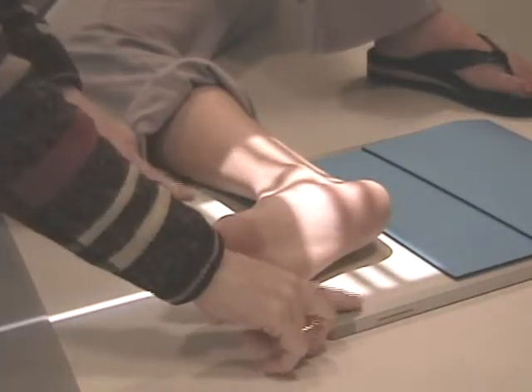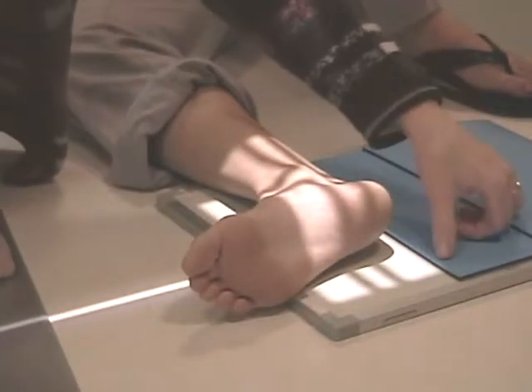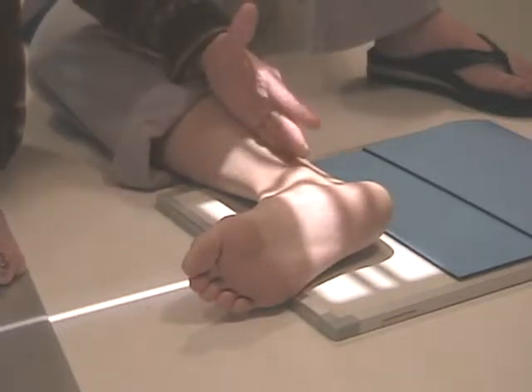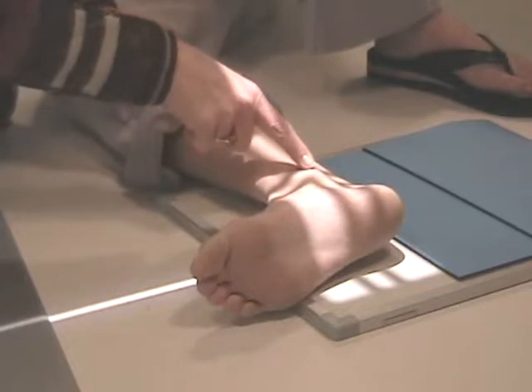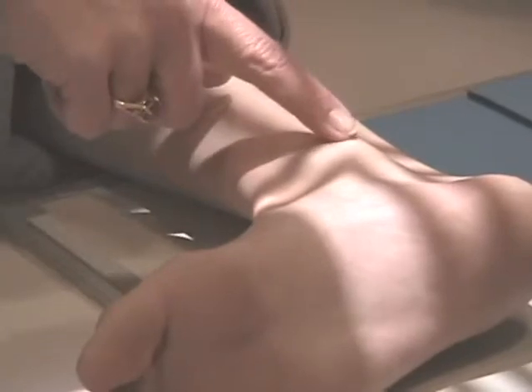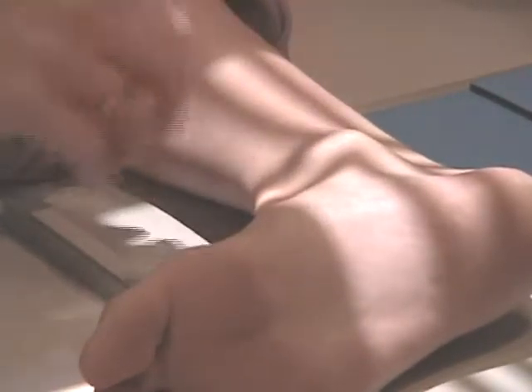Okay, I'm going to maintain this collimation field here so I don't have the stair-stepping across. I have baby light over the blue strip, and I have a little bit of collimation there. The leg is coming down straight, and the joint space is right through that tibial malleoli. I think you can see the bump and the central ray coming right there? That's the joint space. It's basically centered right on the tibia. The fibular malleoli goes more inferior than the medial. So I'm pretty much right on the tibial malleolar line.